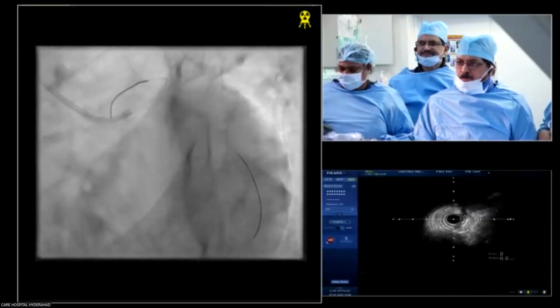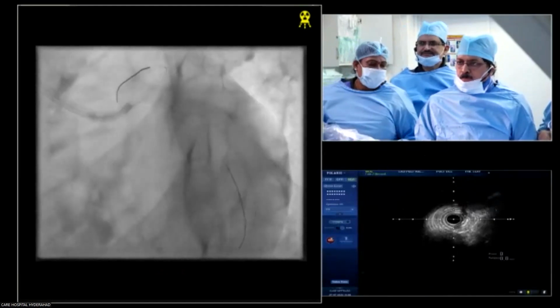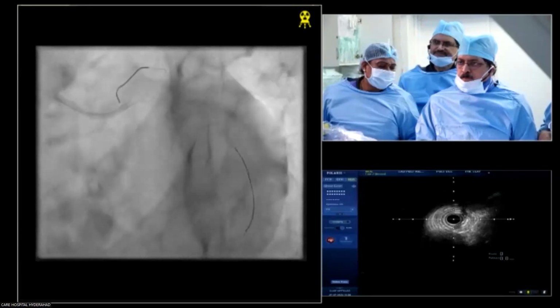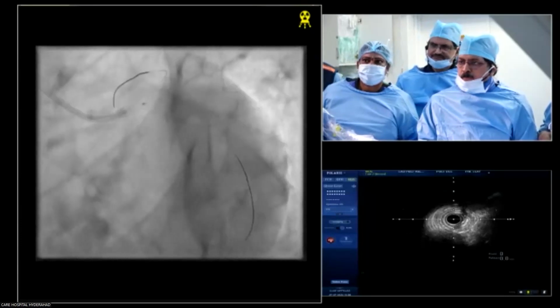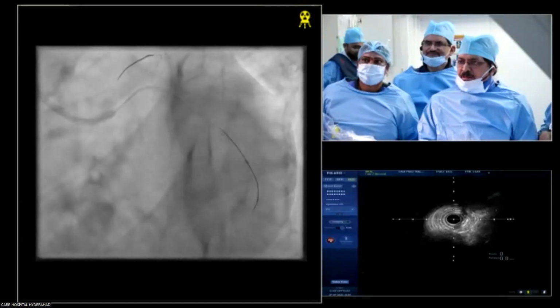But the problem is the NC also causes injury. There is some plaque in the LAD ostioproximal lesion. Definitely that adds some injury. If you are doing that, it is better to do the DEB into the LAD and go with the NC into the LM so that the intimal injury can be avoided. That's my opinion. My IVUS catheter is also easily entering. No problem.